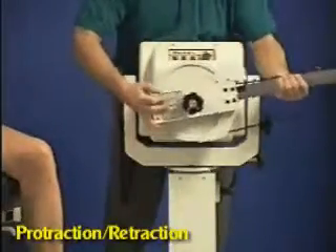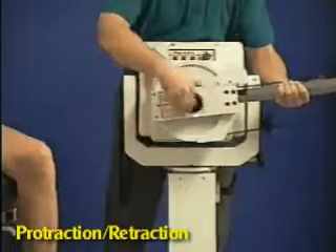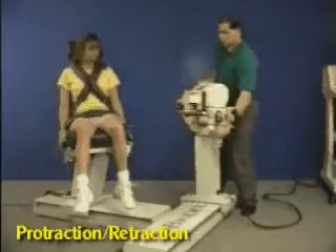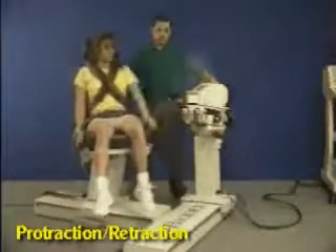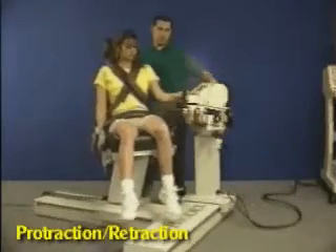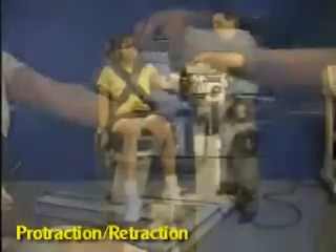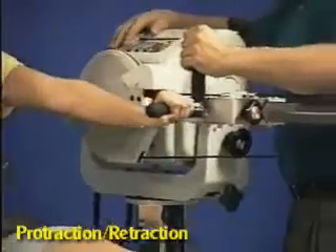Install closed chain attachment to dynamometer shaft. Rotate dynamometer head parallel to the patient's arm and move patient into position. Raise dynamometer to align hand grip with the shoulder, then set range of motion stops.